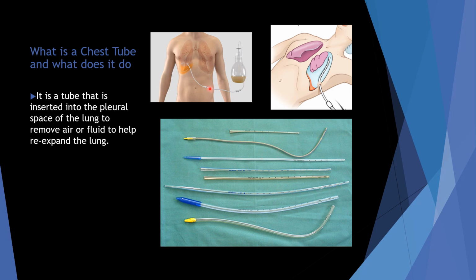And then up here, I have two examples of the types of chest tube placement. On the left, we've got one for a pleural effusion. In a pleural effusion, the fluid, since it's heavier than air, is going to settle down around the bases, and generally you're going to see a smaller tube inserted at the base of the lung. In a pneumothorax, because air rises, you're going to see the chest tube placed high up around the apex.